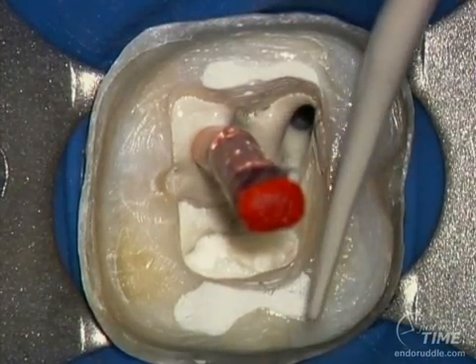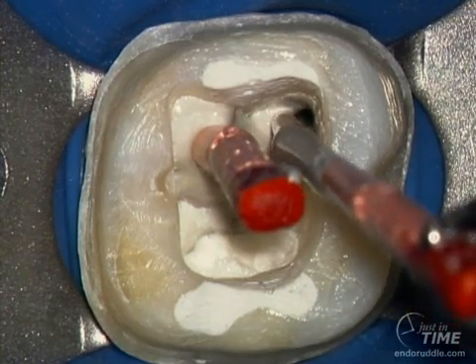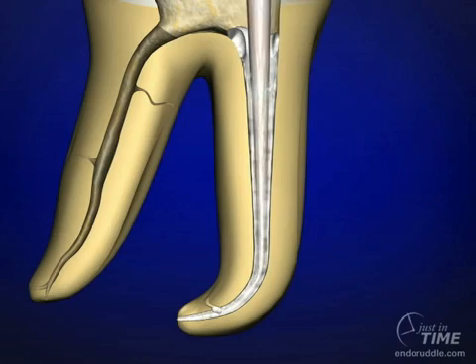Now remove the cone like we showed in the ML, re-inspect it. If it's denuded, we simply re-butter the cone and tease it back to place.